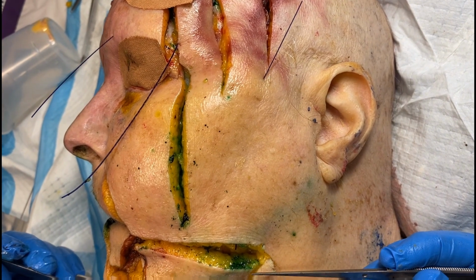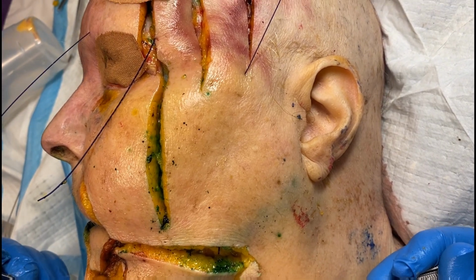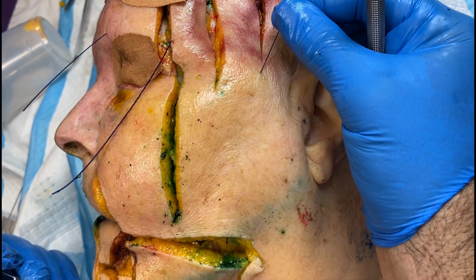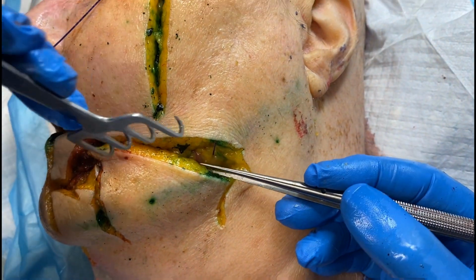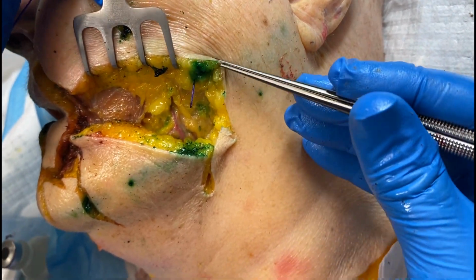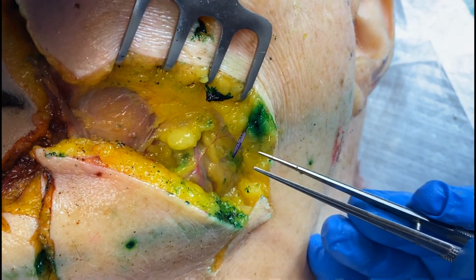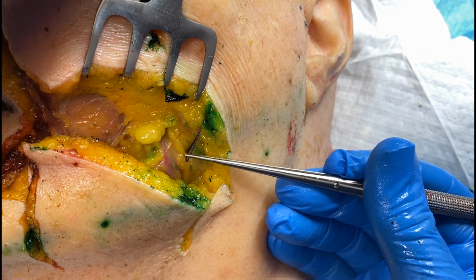All right, we want to show you the power of these PDO threads, and this is the Vsoft Lift brand that we use here. So go to the top where we placed it, Dr. Kimball, and give it a little bit of a tug, and you can see what that tug looks like, nice and strong. Now let's go down to our dissected part and see the end of a thread. This is a very unique view. All these threads are doubled over, and you can see that doubled over part of the thread as it comes out of its cannula and goes around.